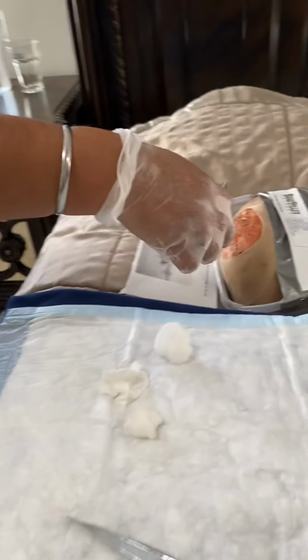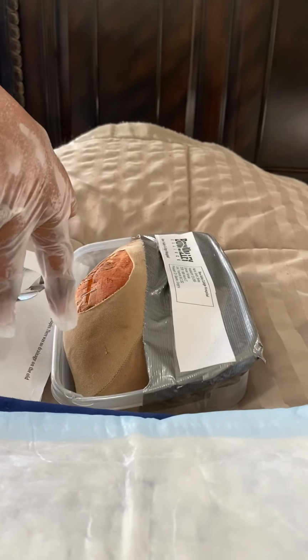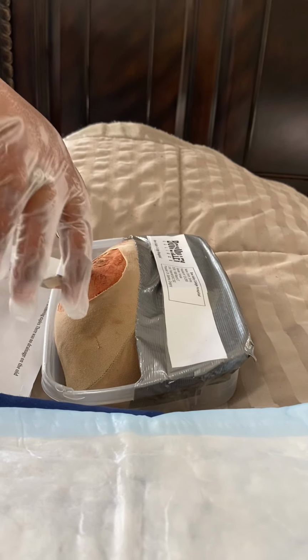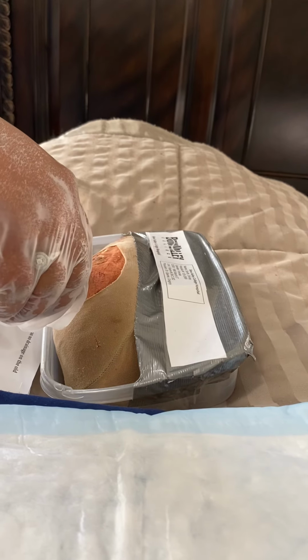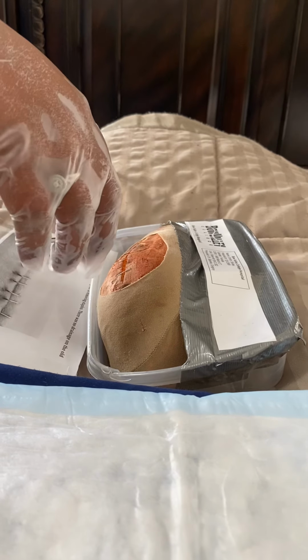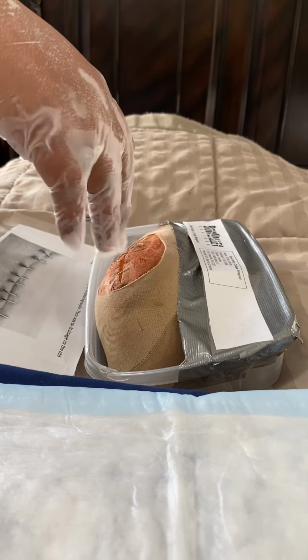Now the fourth one, from underneath, tuck it, gently remove and put it on the side. As I have to count the staples, I put them all on the side. Now the last alternate one, the third one.